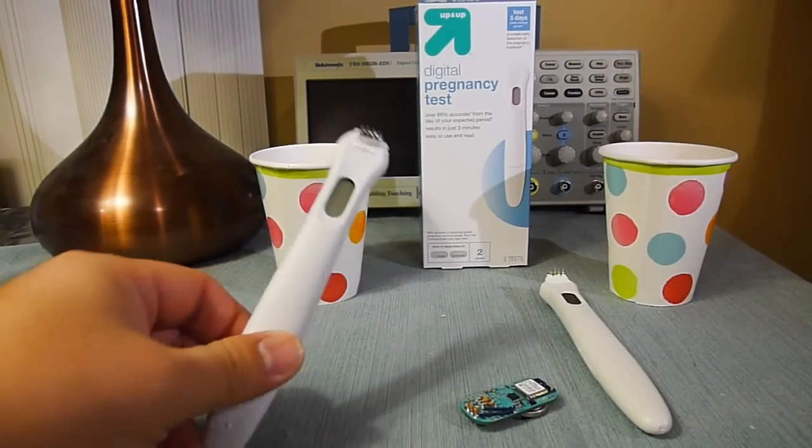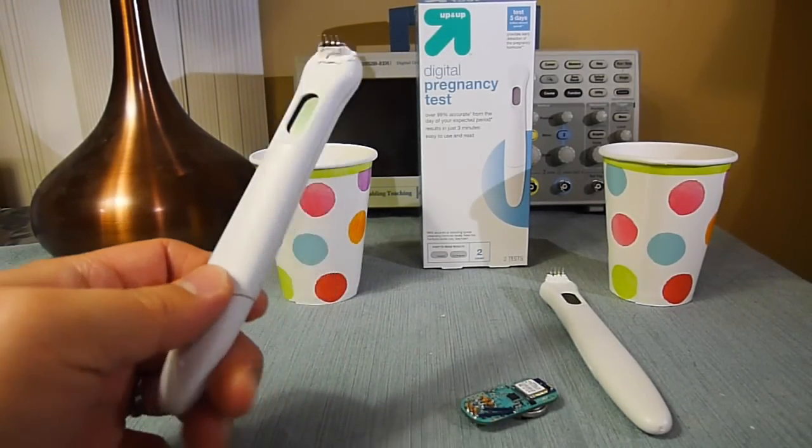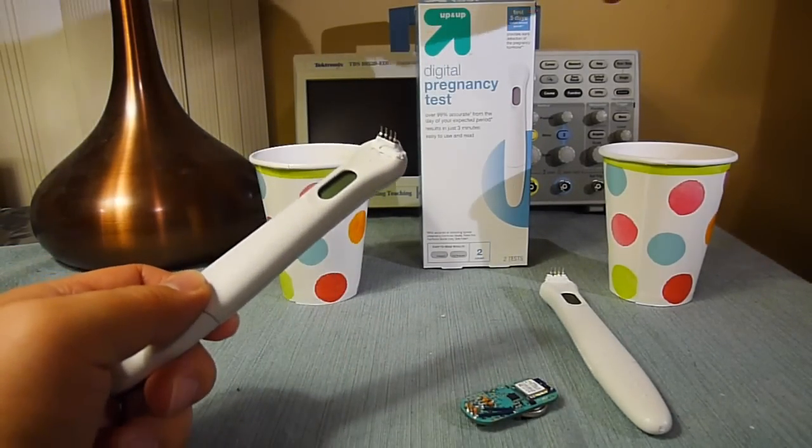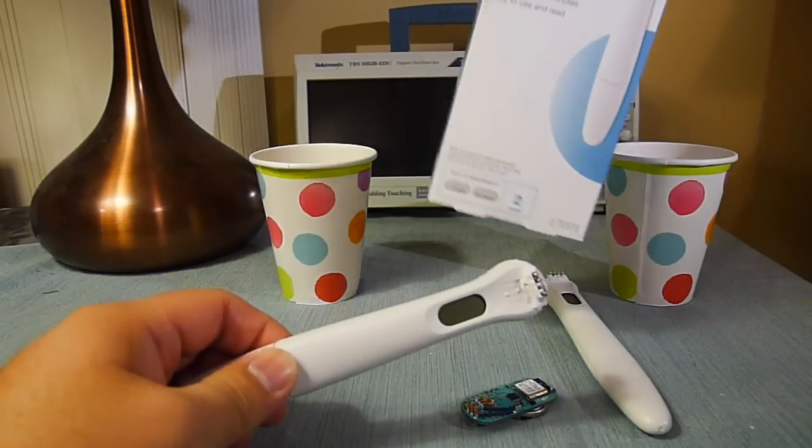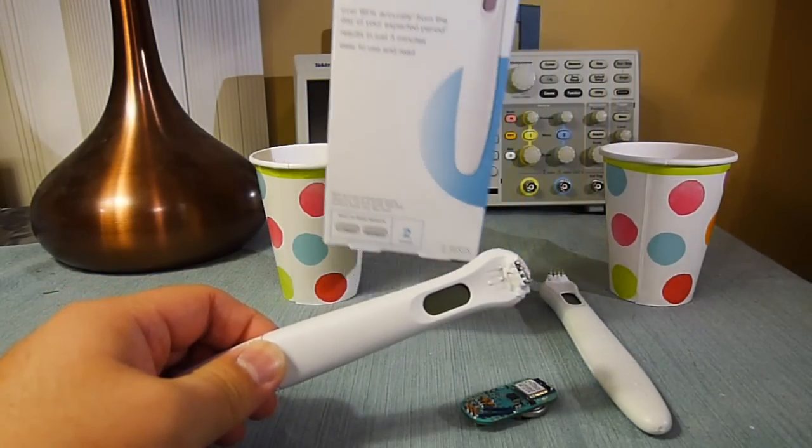This is a demo of this connected pregnancy test. So this is just a pregnancy test I got from Target.